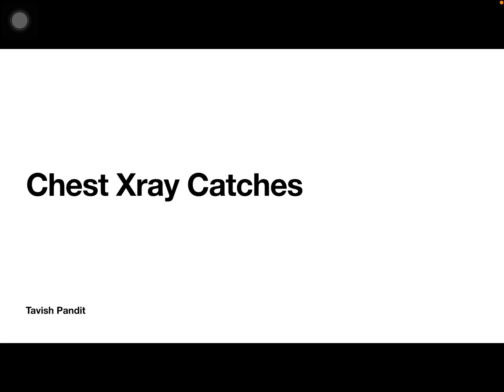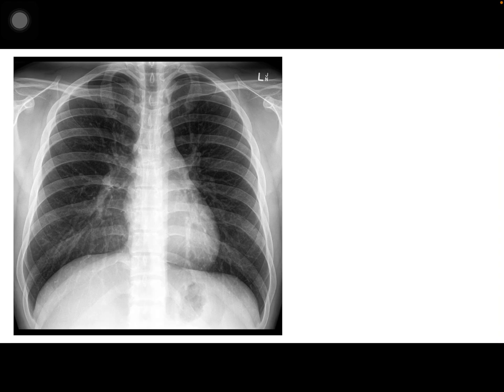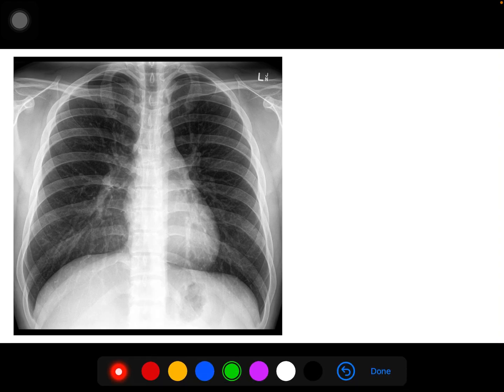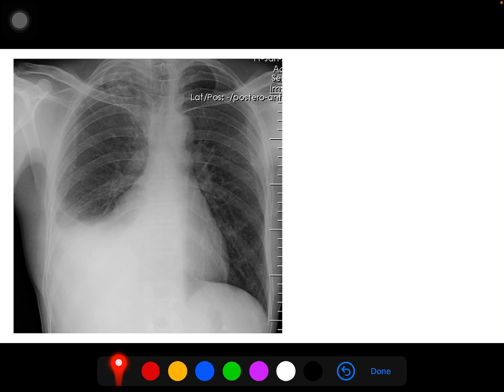Hi guys, today I'll be discussing three pathological chest X-ray images and respective signs which will help you to diagnose them in your questions or in clinics. So first of all, this is a normal chest X-ray. You can see the normal costophrenic angle, the normal cardiophrenic angle, and the mediastinum. I don't have to talk further about it — let's move on.